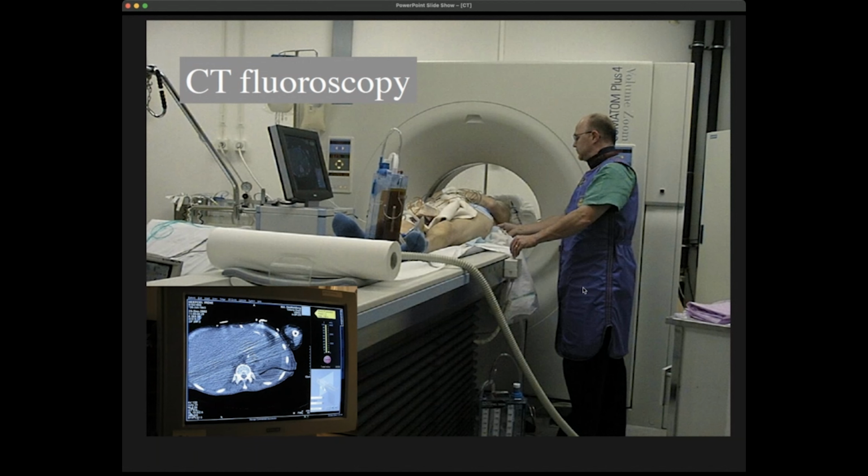You see here is an operator, and one of the things that you also see is that this operator is wearing a special kind of skirt-like or jacket, and also something special around the neck. So this is of course protective dressing. This is lead clothes, clothes that have layers of lead in order to protect the operator from the X-ray radiation. Then you see a setup where we can work at the patient, and behind lead glass, in the operating cabin, is the one that operates the machine.